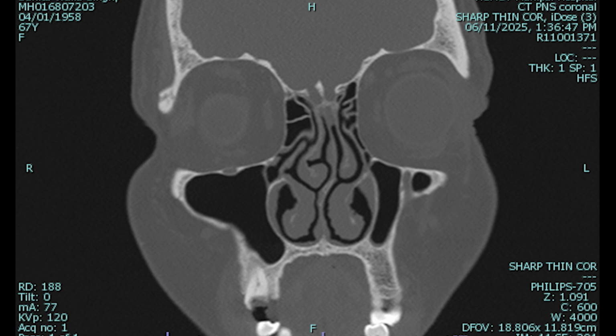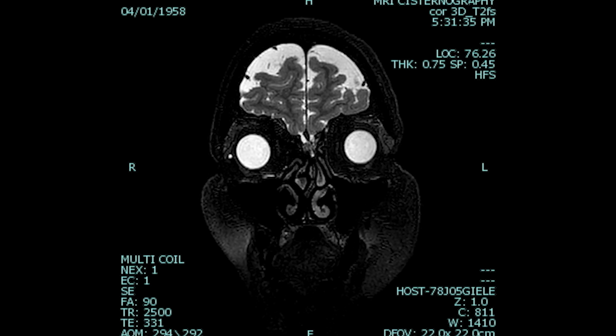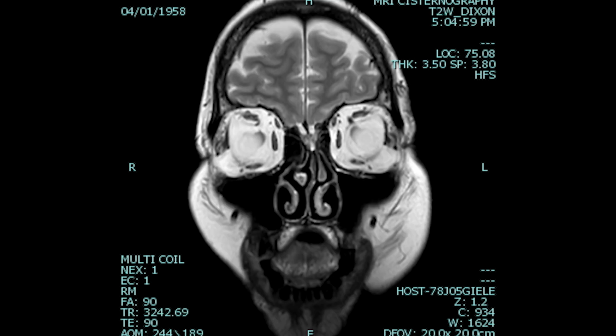This CT scan shows the presence of a focal defect in the left side cribriform plate anteriorly, approximate the level of the bulla ethmoidalis, and shows the presence of a small protrusion seen on the MRI as well, continues with the CSF column, suggestive of a CSF leak or possibility of a meningocele on the left side.